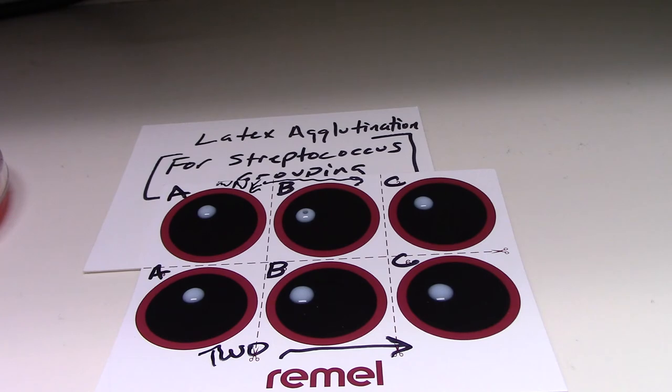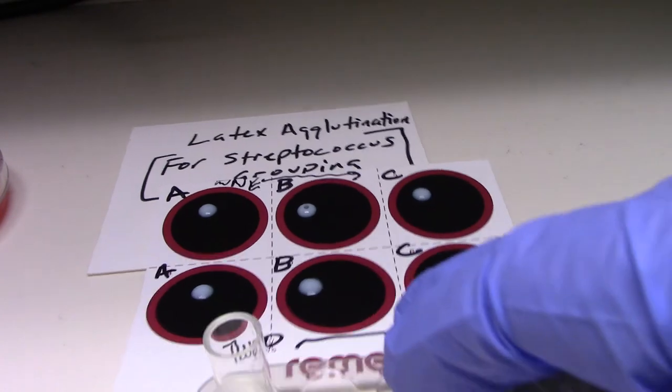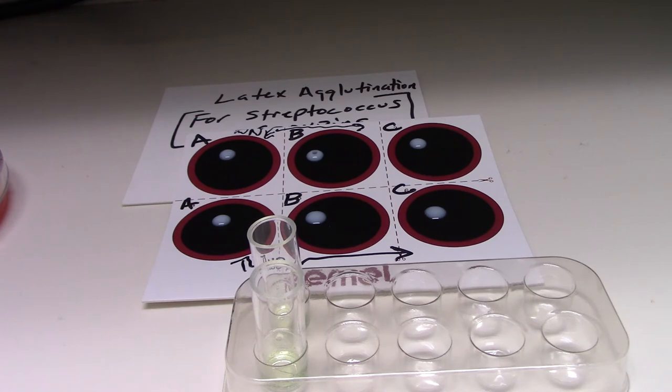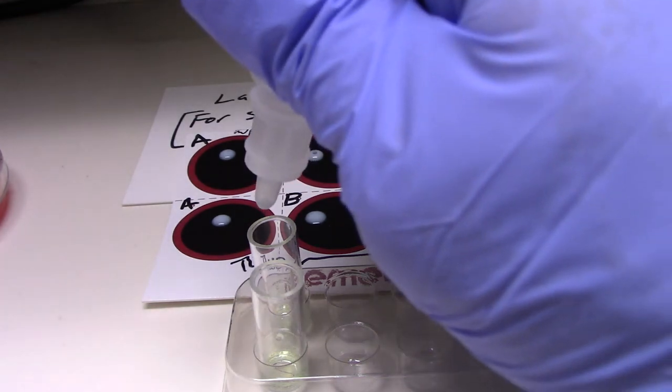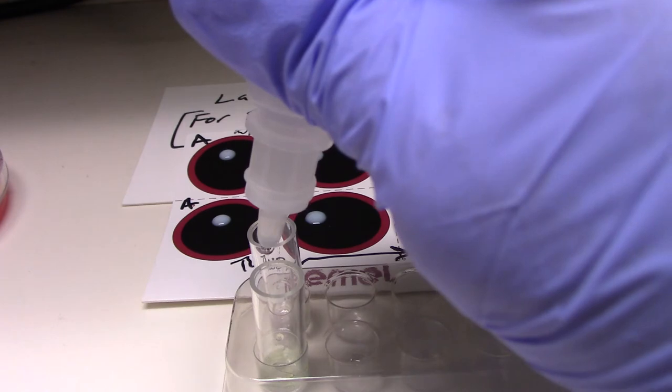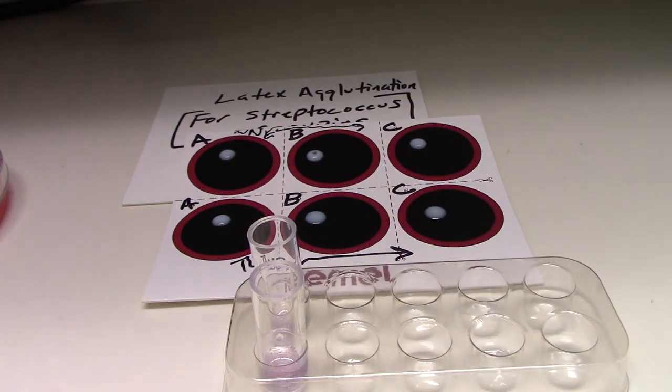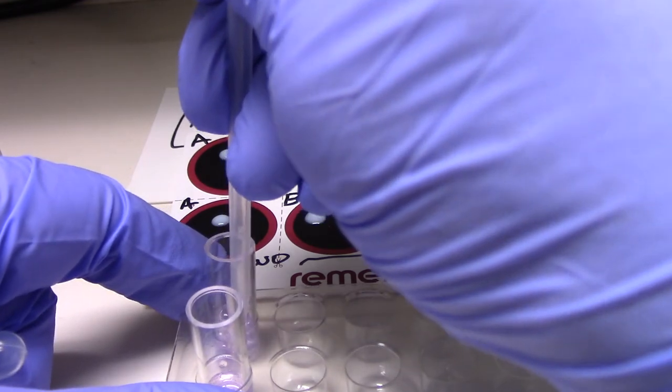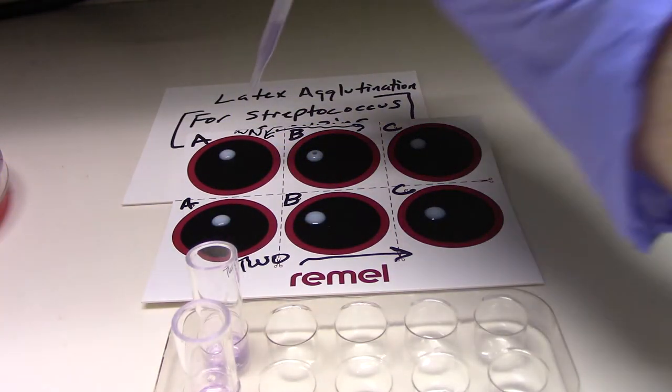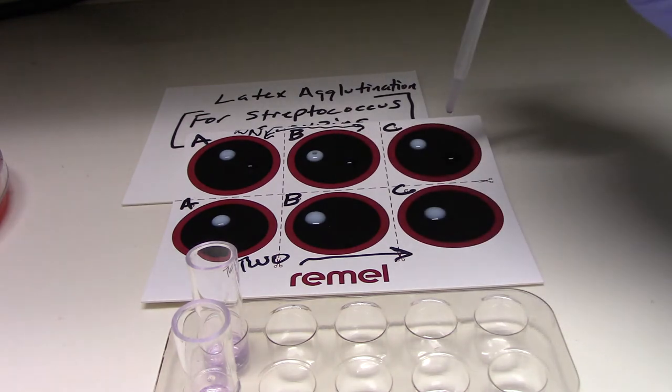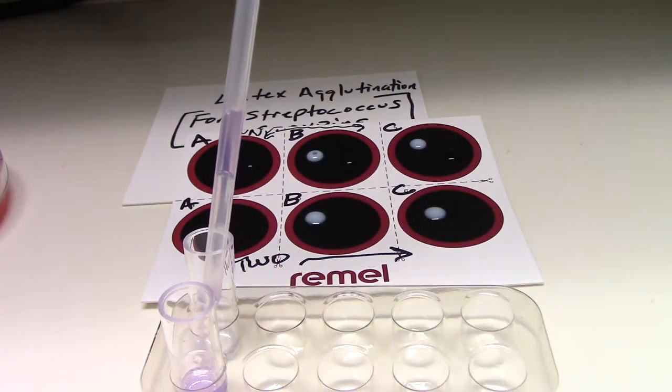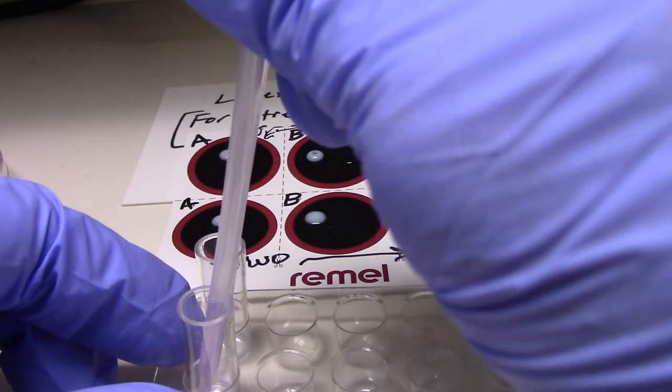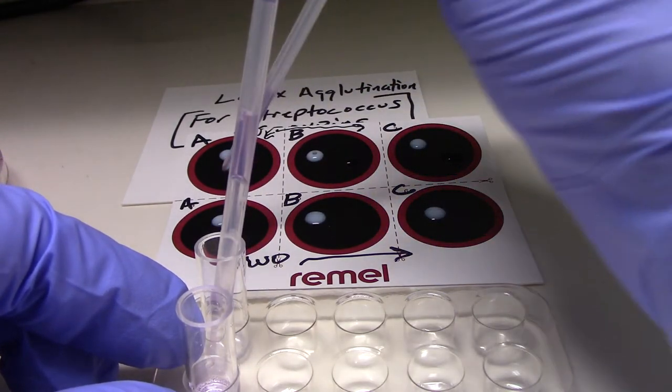So now what we're going to do is neutralize our acid with a base. After we neutralize that acid with the base, we're going to mix our specimens. We're going to add them to the reaction sites. Number 1, number 2.